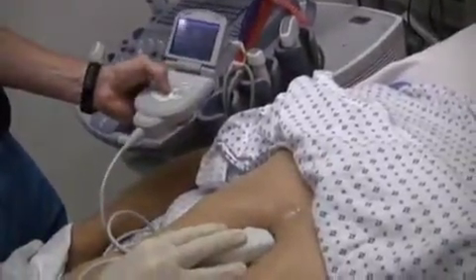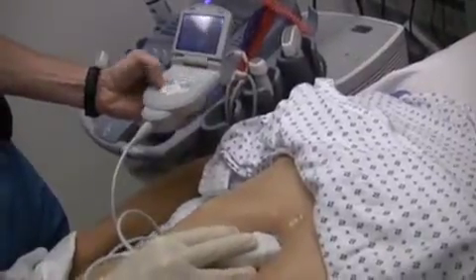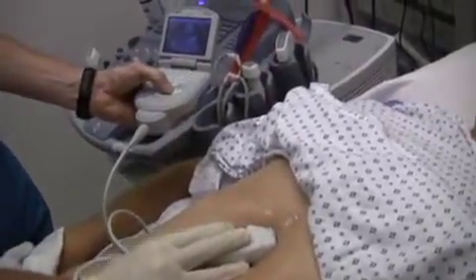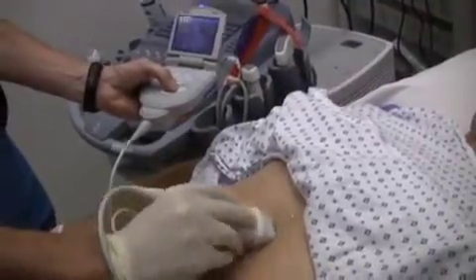We move over here and need to adjust the depth a little bit, then increase the gain a little bit to get a picture of the heart. We scan from top to bottom of the heart. We can see the anterior and posterior pericardium very nicely on this image. No free fluid.